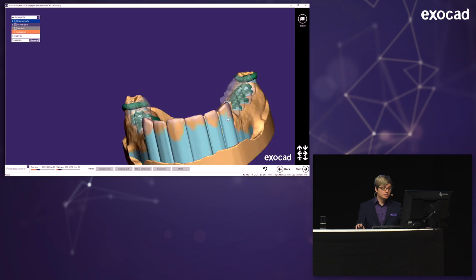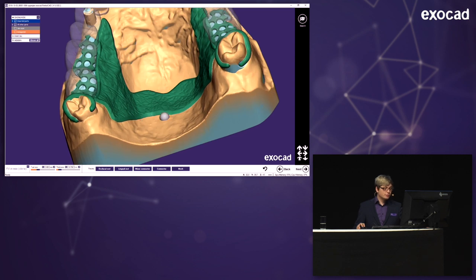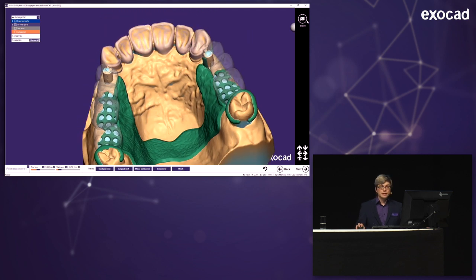And now I have a tool to fill in some wax. And the way this works is that it only fills in wax directly on the refractory. So I have here a thickness. If I try to fill it somewhere where there's already thicker wax, you won't see it because it's lower. But we will do this later, because now I'm the first time switching to the expert mode. And expert mode looks a bit like this. It's just a plethora of tools.